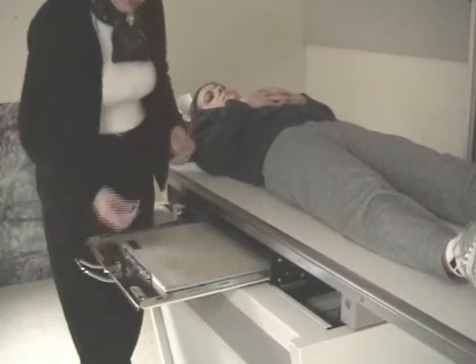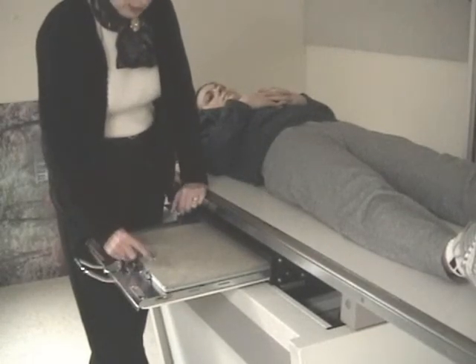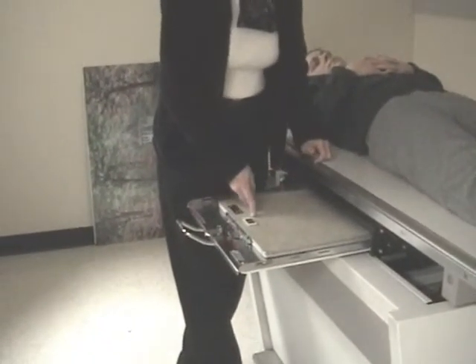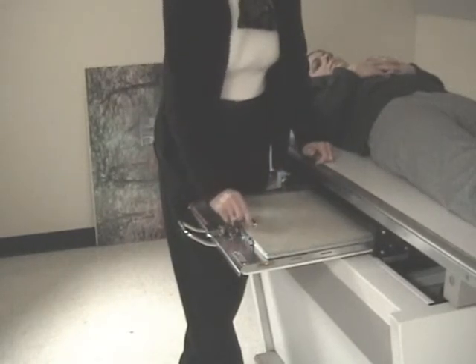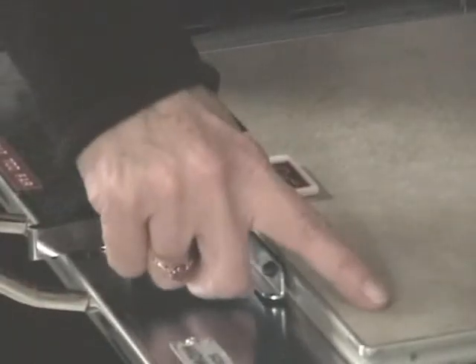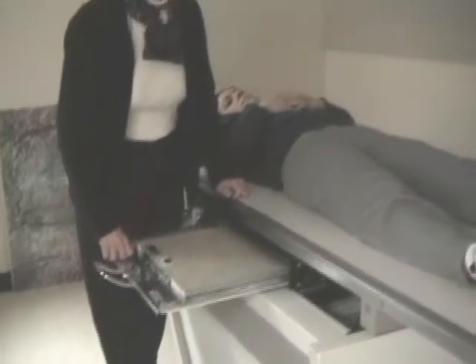I'm going to use an R marker. Usually we try to put the R markers in the corners, but because of the unusual shape of the pelvis, the wings being wide, then it dips in, and then the trochanter comes back out, I'm going to put that R marker in the center of the cassette, hopefully keeping it out of the way of pertinent anatomy. Again, the trochanter could be down here, so we put it in the center. And when we look at radiographic images, I think you'll understand what I mean here better than this actual talk today.